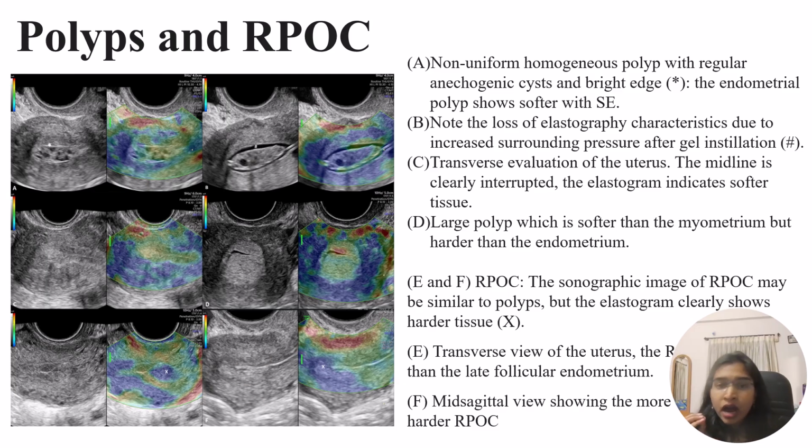So if we have to differentiate between RPOC and polyp, polyps usually appear soft, while RPOCs appear hard in the elastography, and by that we can differentiate.